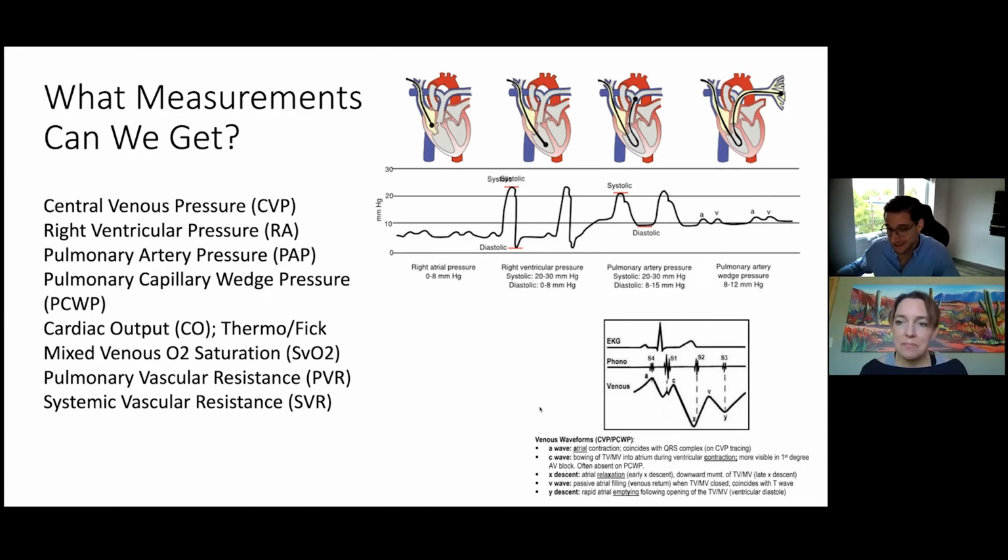On the tracing, which I think is very nice. Correct. And the size of the waves will be proportional to the diastolic filling time. So if you see a larger R to R interval, after the large R to R interval, that next beat will be larger. And so when someone is in atrial fibrillation, you need to average out several in order to get the true filling pressures.